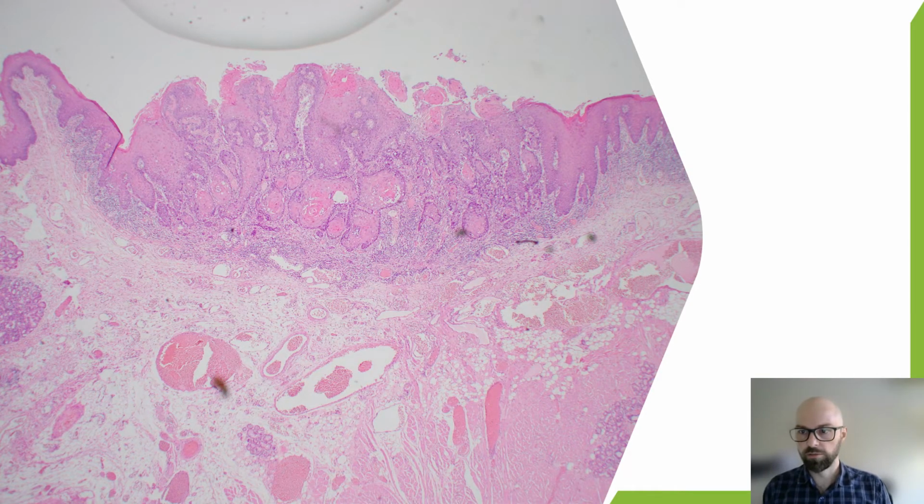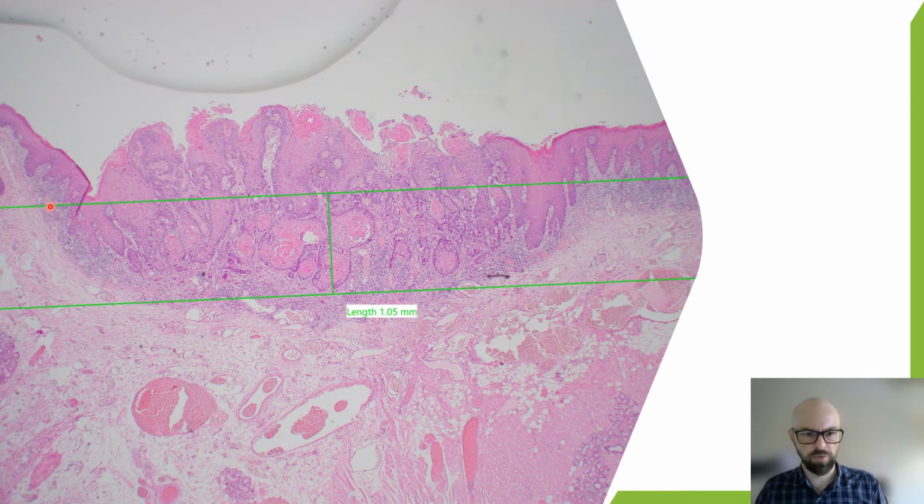Another common issue is the mucosal irregularity, which you get at the border of the lateral tongue when it turns into the floor of mouth. And we can see here the floor of mouth coming off at a different angle. This is the edge of the tongue, the border of the tongue. Thankfully, this one isn't too difficult. We've got the normal mucosa here and here, and then we can just draw a line straight across and get the depth of invasion down.